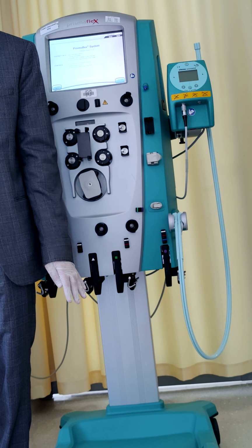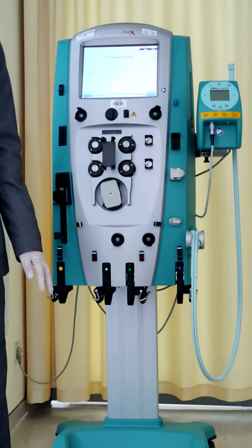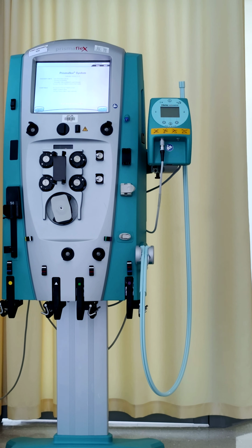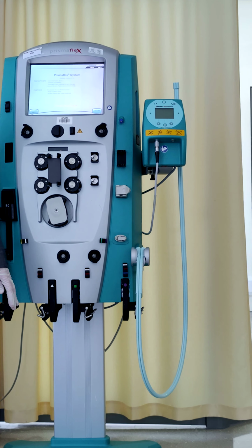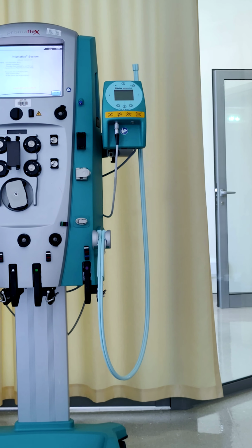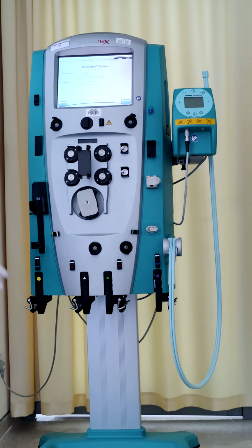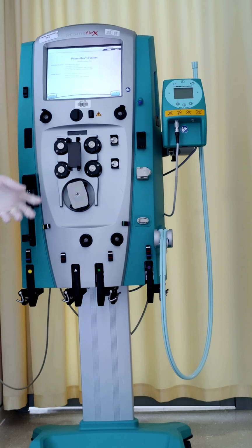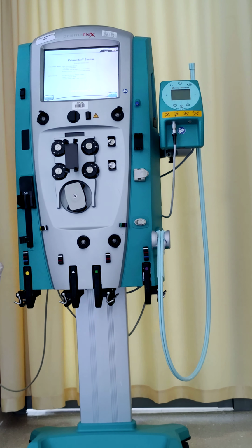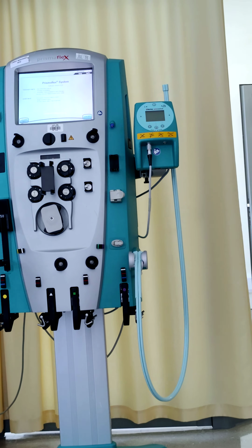Yes, we can use it, but this one is 5 liters of normal saline, and you are using a small amount. You need 100 ml or 80 ml per hour for 3 hours, so only about 250 ml. If you have a 500 ml saline bag, that is fine, but you have to change the bag for it. Okay, yes, that's all.